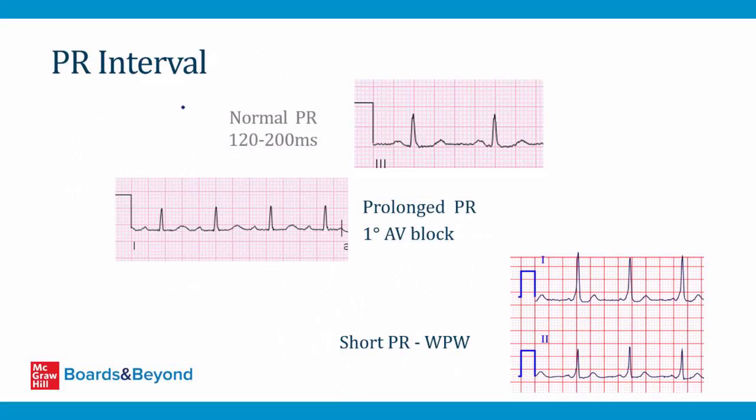Okay, now let's switch gears and talk about some of the important intervals you can measure on the EKG. We'll start with the PR interval.